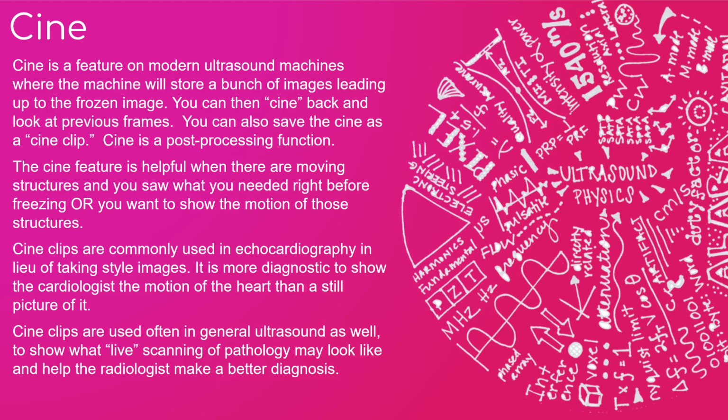Echo, on the other side of things though, actually almost uses cine exclusively. So instead of taking still images, echocardiographers quite often take clip after clip after clip, and it's only 2 or 3 seconds for each one, but it's easier to show motion to the cardiologist through clips than it is through a still picture. So quite often cine clips are used in 2 to 3 second bursts to show wall motion, to show how blood is flowing through a valve, to show how the heart's contracting, that kind of stuff. So it's not uncommon for echocardiographers to only use clips, or general is going to use it more to display pathology to the radiologist.